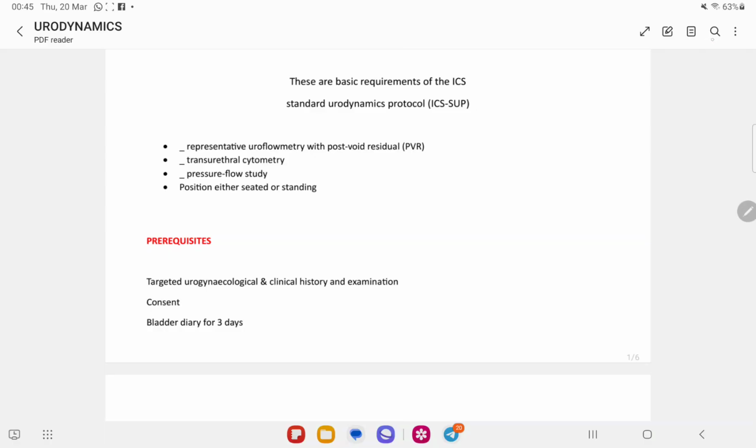These were just the basics because these were important for your clinicals of the FCPS as well as for your question solving in MRCOG 2. And tomorrow I will be teaching you the station, that how you will tackle the station if you get the urodynamic as a teaching station.